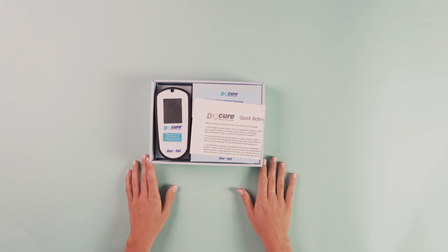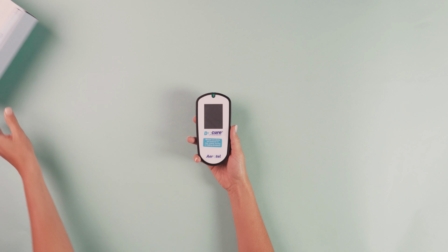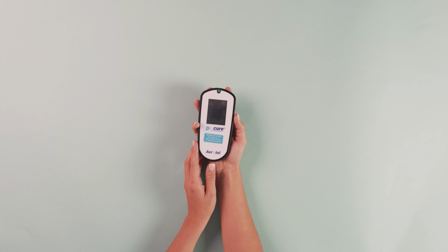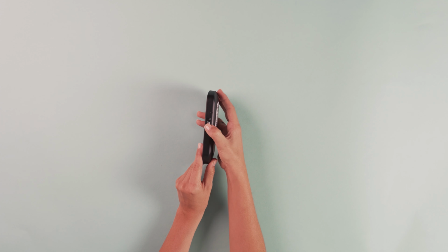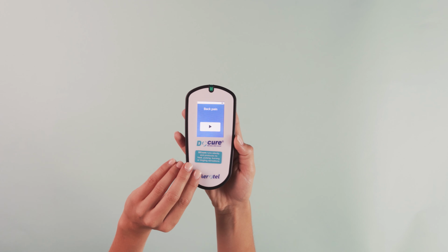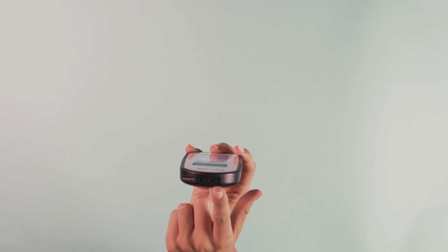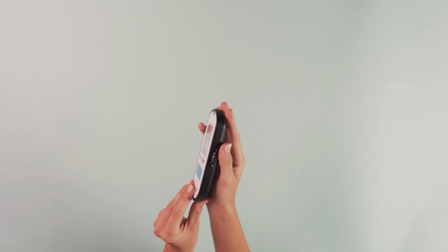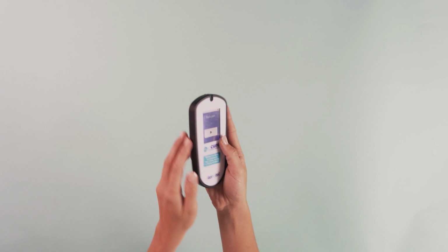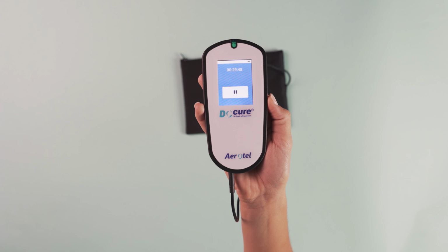DC Cure comes with a rechargeable lithium battery, a large touch-sensitive digital screen used to start and pause DC Cure, a main power switch on the right side of the unit with off and on positions, an LED light at the top of the unit which flashes blue when the unit is on, a treatment pad cable plug socket at the bottom of the unit, a USB power cable socket at the bottom of the unit, and small notches on the left and right sides of the unit used to attach the belt clip. The display also shows a treatment countdown clock and battery charge meter when the unit is on.